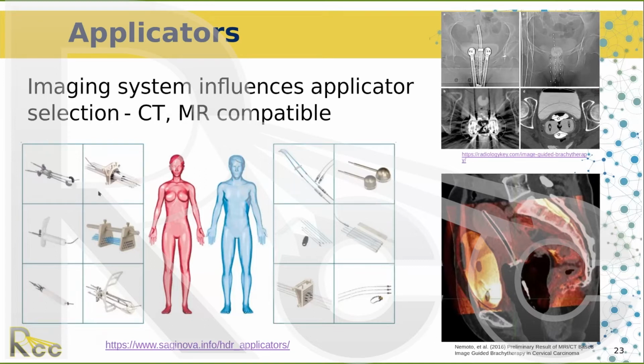And it goes without saying that the patient population, in terms of what type of treatments you're going to provide, has a big role in the applicators that you purchase. Here in the upper right hand corner, you've got some surface applicators for skin cancers, superficial lesions, and keloids.